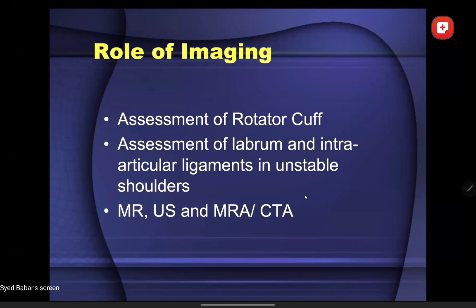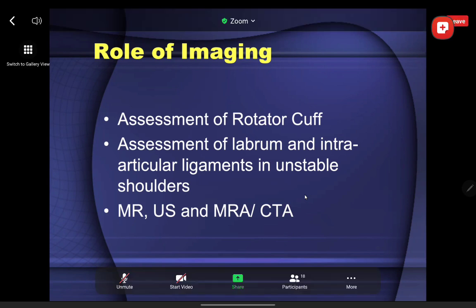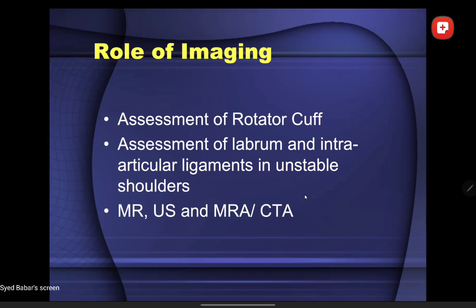reasonably good MR machine, which I know you don't have at BMC because you have something like a point something permanent magnet, which doesn't give you that good a quality. But most of the departments in the UK have 1.5 and 3 together. So in every department, this is the combination. How many depends on the extent of the referral center. So, for example, we have about 8 or 10 MR scanners, but in a normal DGH, there would be at least 2, if not more, and the combination is usually 1.5 and 3 Tesla.